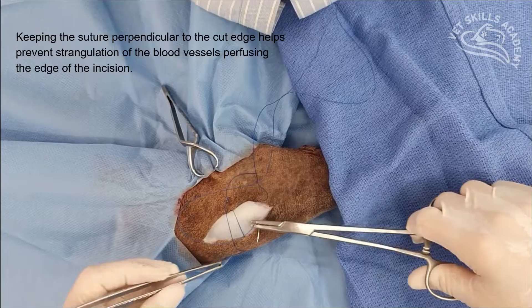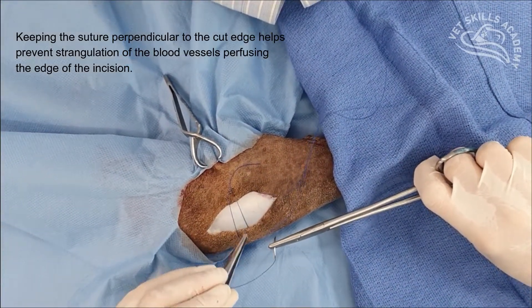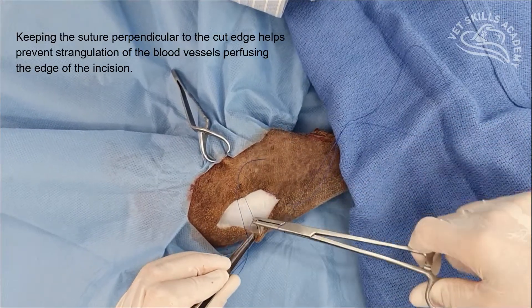My last bite is going to be near. And once again, we're keeping everything lined up, perpendicular to the incision site. And we go near.